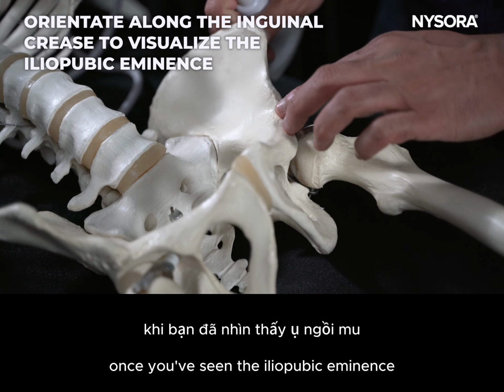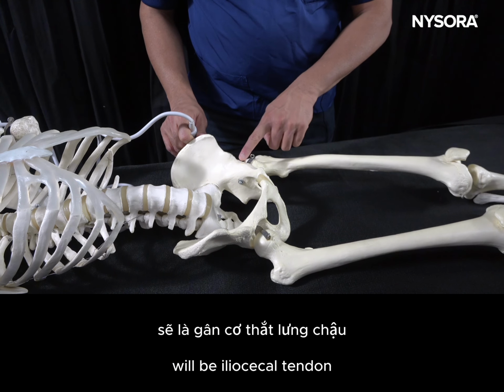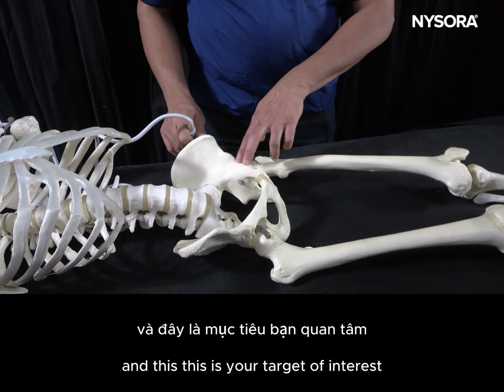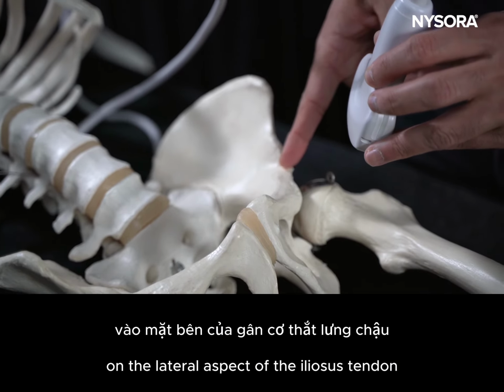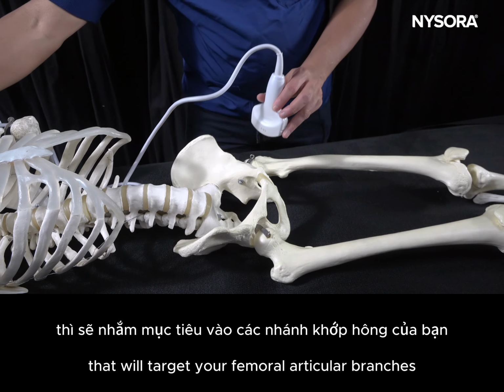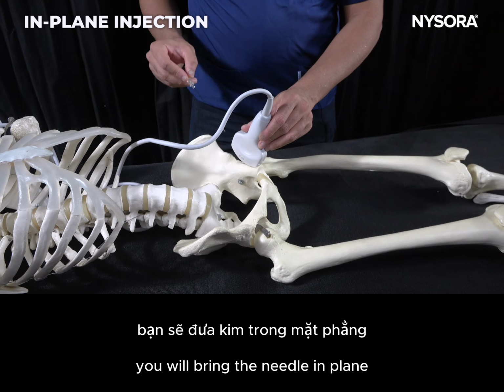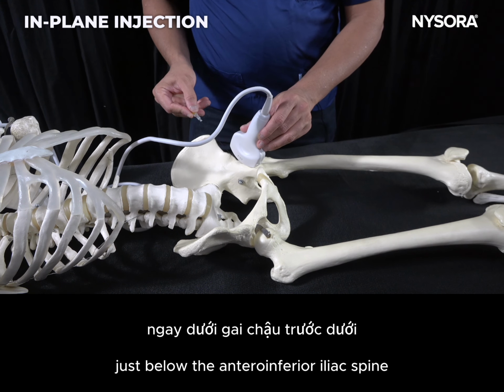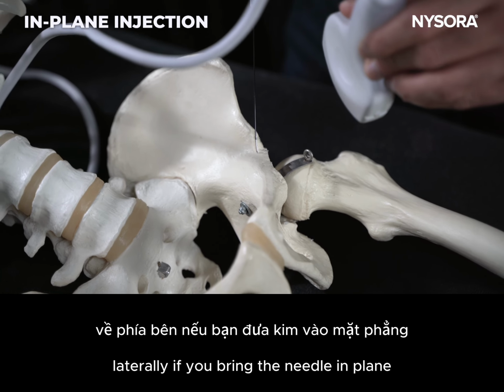Once you have seen the iliopubic eminence, the soft tissue structure that you'll be able to visualize will be the iliopsoas tendon. And this is your target of interest. If you inject the local anesthetic on the lateral aspect of the iliopsoas tendon, that will target your femoral articular branches. To perform this injection, you will bring the needle in plane just below the anterior inferior iliac spine and park the needle next to the iliopsoas tendon laterally.